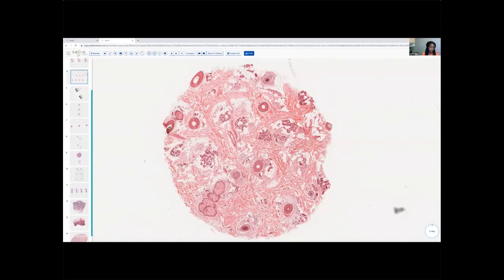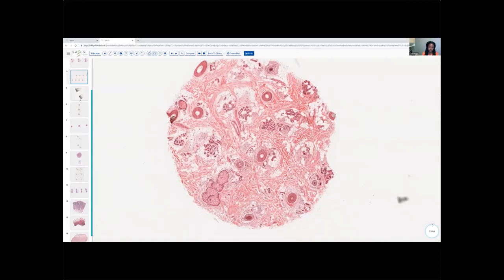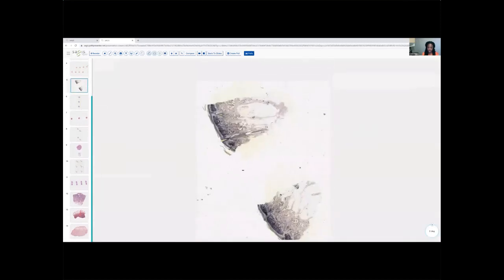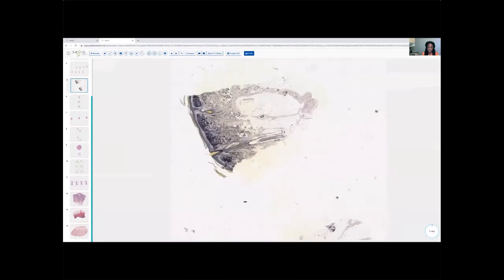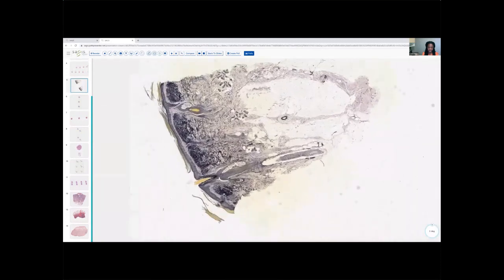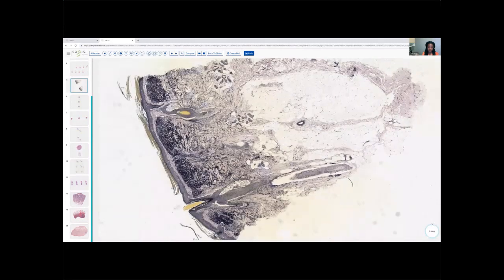All right, so two last points about the androgenetic alopecias. So I mentioned the fibrous streamers, and there are stains you can do. There is Elastin Van Gieson stain that can just show you that tract that the follicle makes as it moves up into the higher levels of the skin with miniaturization.